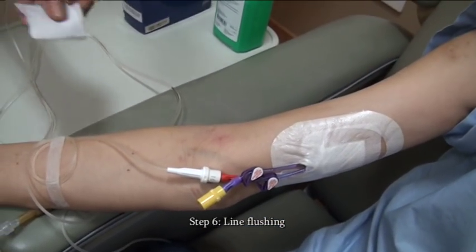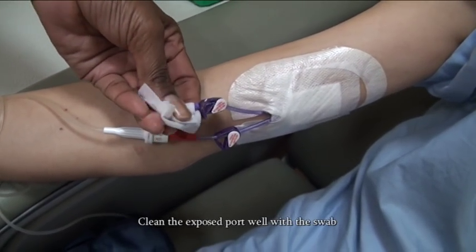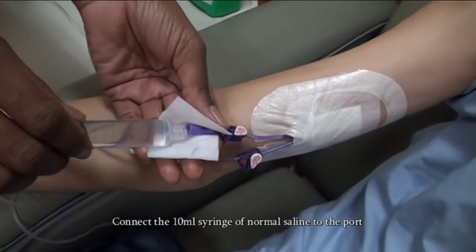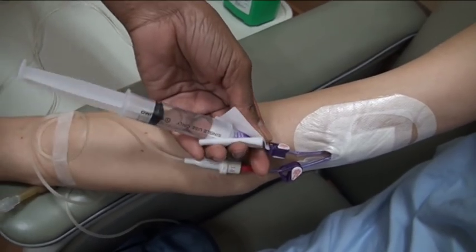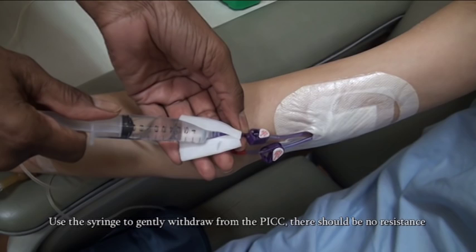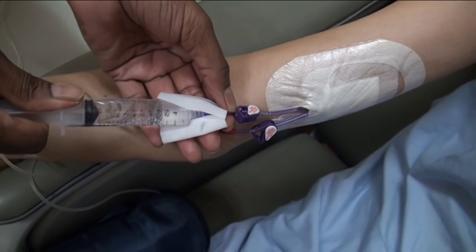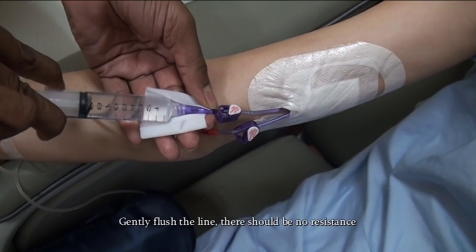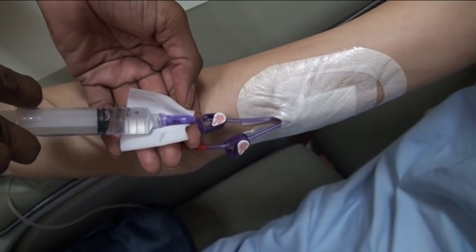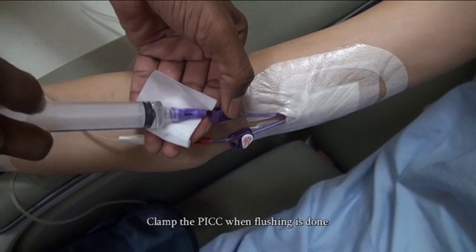Step 6: Line flushing. Take a new alcohol swab to clean the PICC port before uncapping it. Clean the exposed port as well. Connect the 10ml syringe of normal saline to the port. Unclamp the PICC. Use the syringe to gently withdraw from the PICC — there should be no resistance; look for backflow as well. Gently flush the line — there should be no resistance. Clamp the PICC when flushing is done.